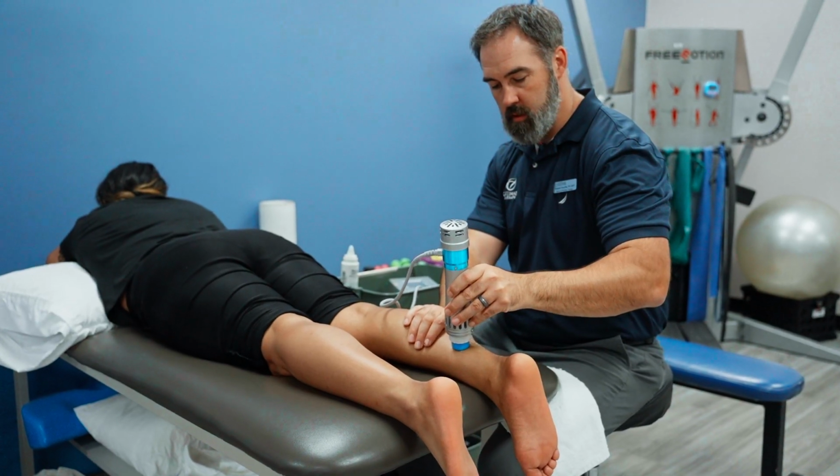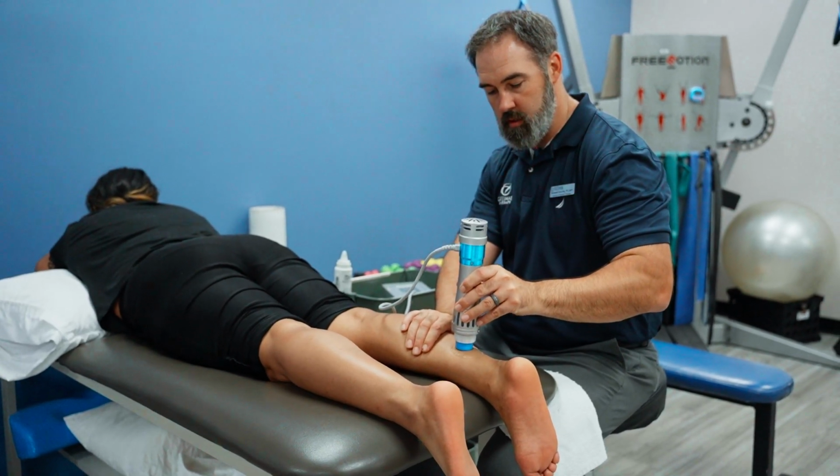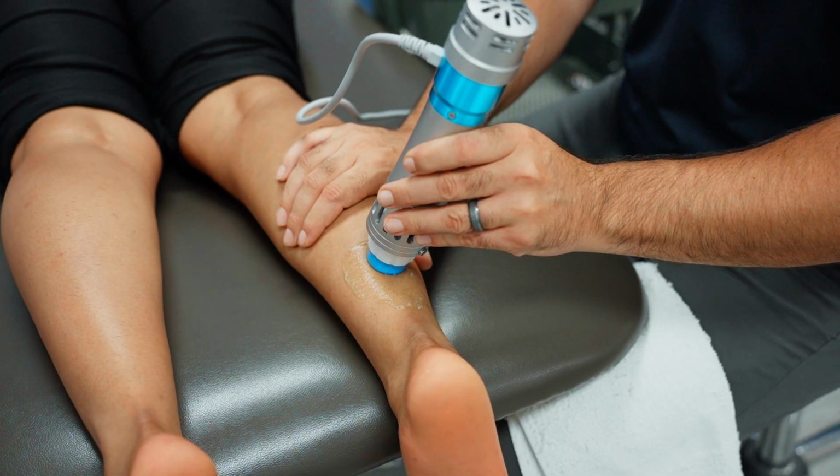So during treatment, you should expect, it really does feel like getting flicked a bunch or hit by a reflex hammer a bunch of times for several minutes. Sometimes it can be a little tender. I think it's a little on the loud side, but it just feels like that. A lot of times we'll use ultrasound gel to help the tool slide over the skin, but it's not necessary. For a larger area, like if I was gonna do the calf, I'd use a larger attachment that slides a lot better without the ultrasound gel.